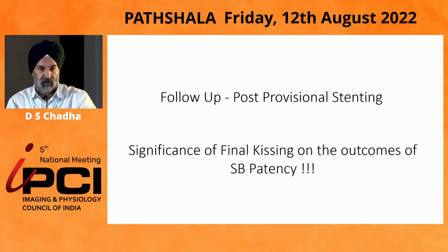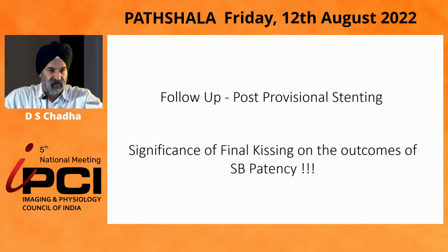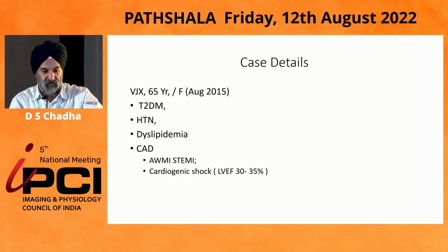Well, I'll come to the second part of the talk, and I'm going to show you 2 cases. These are both cases which underwent provisional stenting. In one of them, we went ahead and did a KISS, and the other, we did not do the same. So we are going to look at the patency of the side branches.